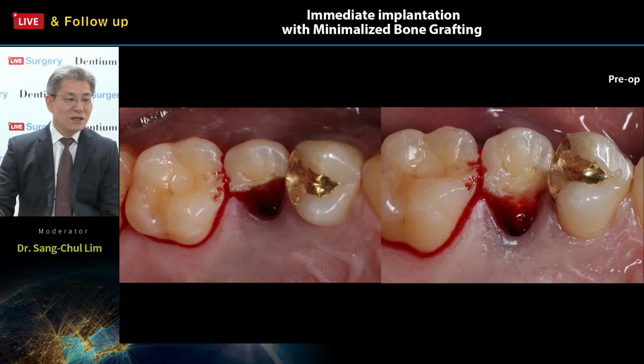So in this case, crown lengthening means excising the gingiva while we preserve the biological width between the gingiva and the alveolar bone margin. And then we do crown preparation and crown delivery, including root canal treatment or not.